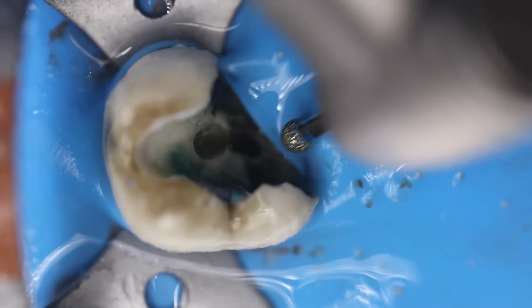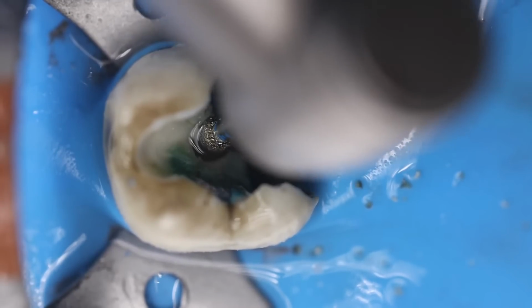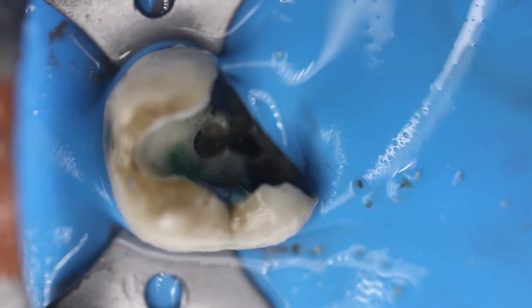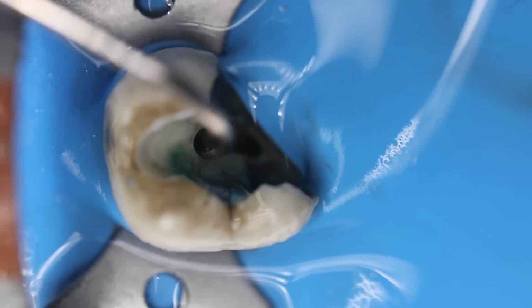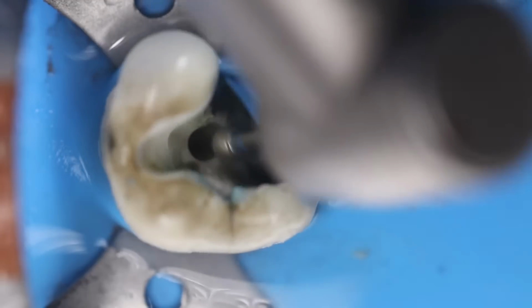Irrespective of whether you are visualizing the orifice over here, you have to get that bur drop. So this is the bur drop that you will get. You may clear the things so that you can visualize it. Okay, now this is the bur drop. Once you have obtained this bur drop, you can slowly remove the roof of this pulp chamber with this round bur itself. Now do not go deep, just remove it slowly.